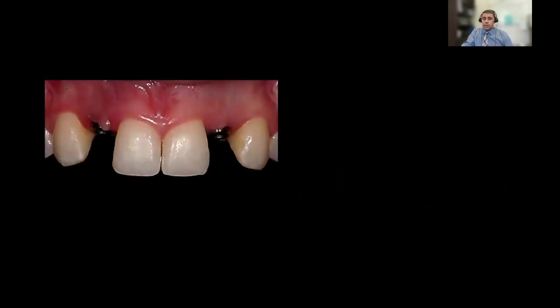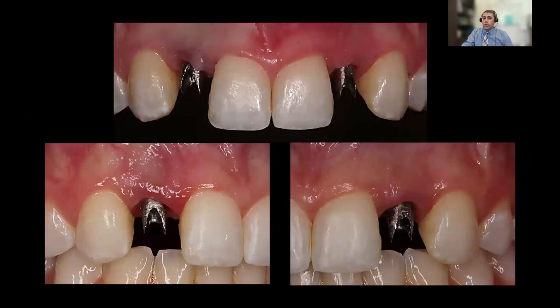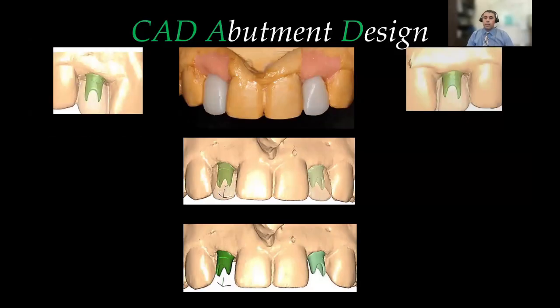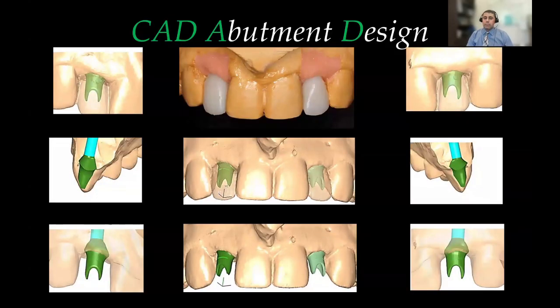After second stage, to achieve a better aesthetic outcome and sculpt and manage the soft tissue very nicely, we did that with provisional restorations. Afterwards, we fabricated computer-aided design, fully anatomic abutments designed for Emily. Those were titanium Atlantis abutments from Dentsply Astra at the time, gold shaded, so we can maintain titanium to titanium contact inside the interface.